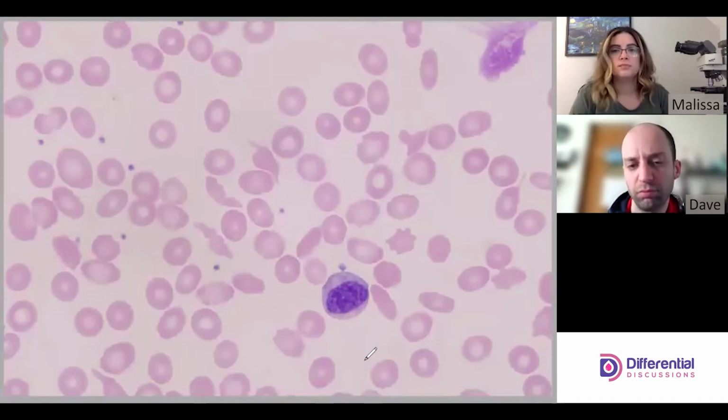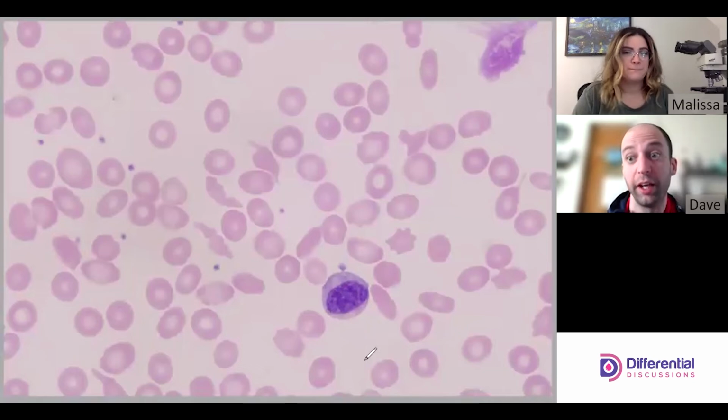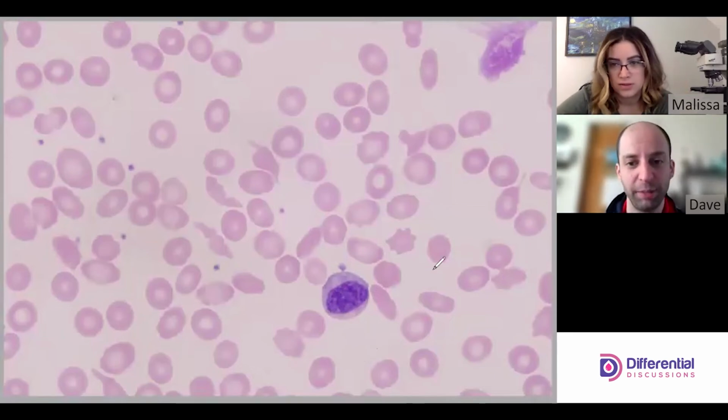We'll have a more full video on this subject for sure. We're not at white cells yet. Cool. But other than that, there's some acanthos here. There are. So acantho, acantho, acantho.